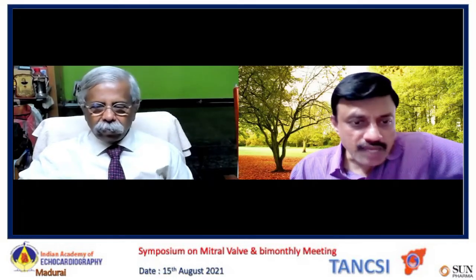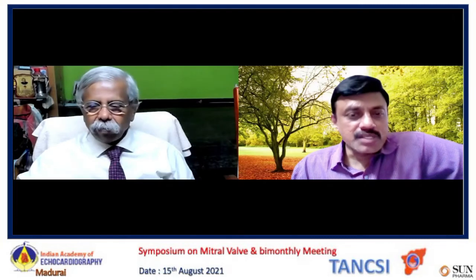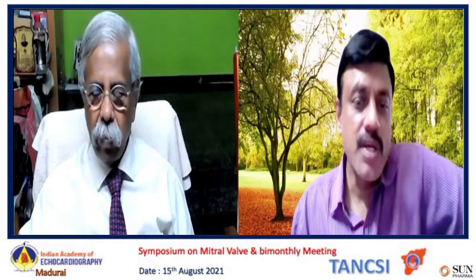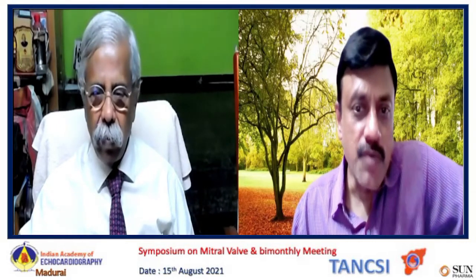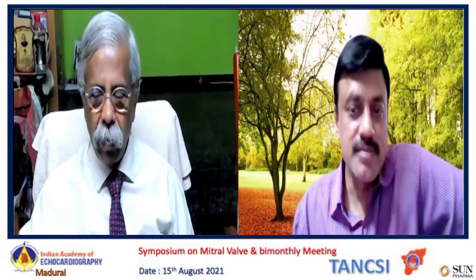We should always have surgical backup, because many times it can have severe MR and the patient might need an urgent MVR. But some of the patients do respond well to balloon. So we were having that plan in mind, and hence we were imaging accordingly, sir.